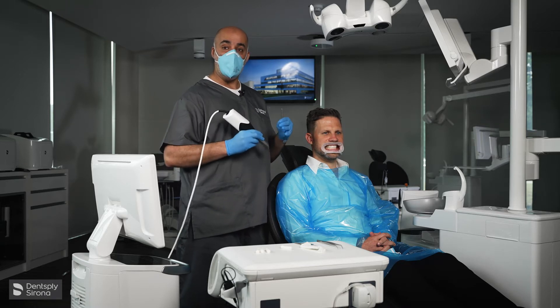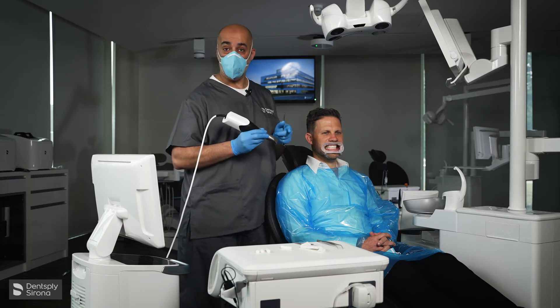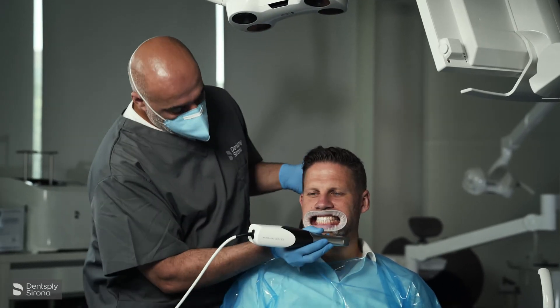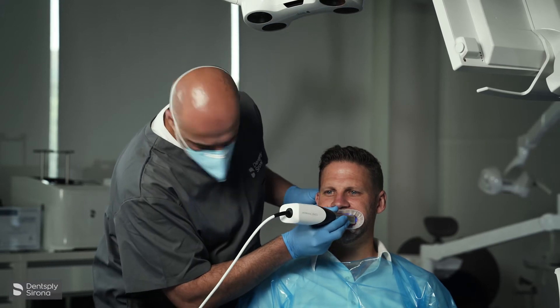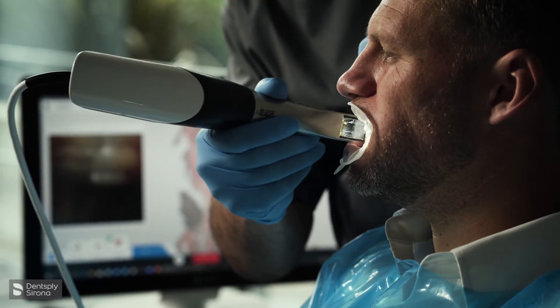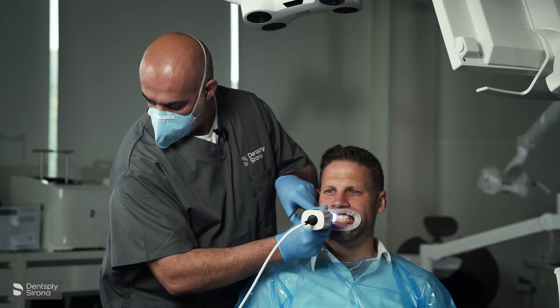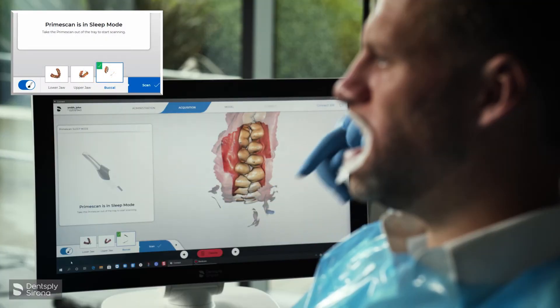We need to scan either side of the premolars — left and right — to stitch it together. I'm going to ask the patient to bite together, not clench, so teeth should just be touching. I'm going to record the buccal upper and lower on one side, and then the other side. You'll see a green tick appear, confirming it's done, and we can now move to the model stage.